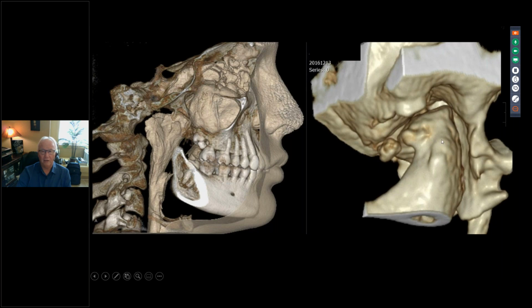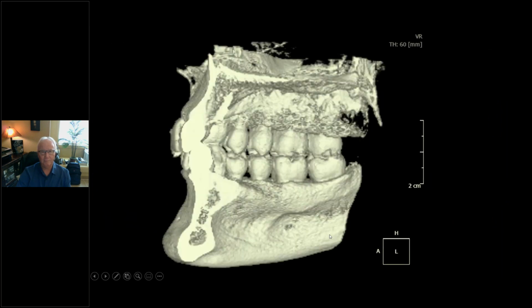The image on the right is a three-dimensional condylar head with changes on the articular eminence and a loose body in the joint space. Well, you would think about this in a thin slice grayscale view. If you had a 1/10 of a millimeter slice, you might pick up a part of it here and look small, and then as you get further in, it looks bigger, a little round opacity. And I always say this when I lecture, you CBCT owners need to learn and understand the tools in your toolbox, because you can do most of these things in the three-dimensional software that comes with your machines.